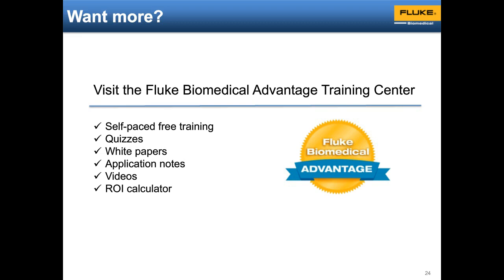Okay, thank you. And what is the best way to test Masimo rainbow parameters? So we have a product, ProSim8. There are other products out there to test it. The important thing is that typically you have to have a very specialized tester or accessory to be able to test it, because the Masimo uses different photo emitters and different photo detectors.